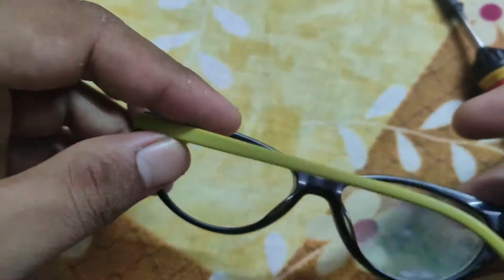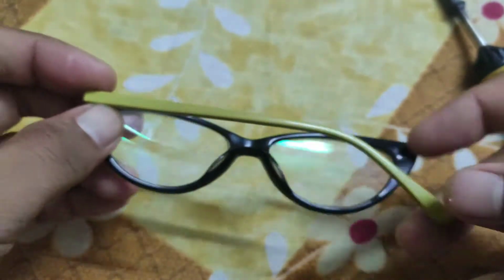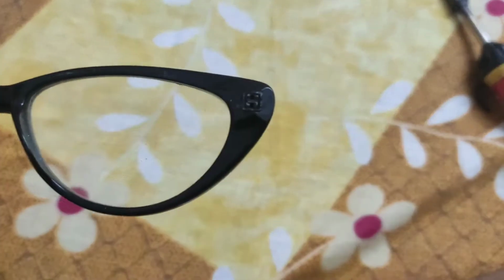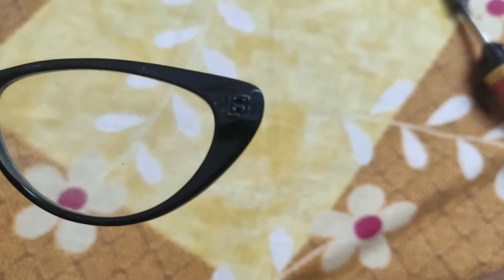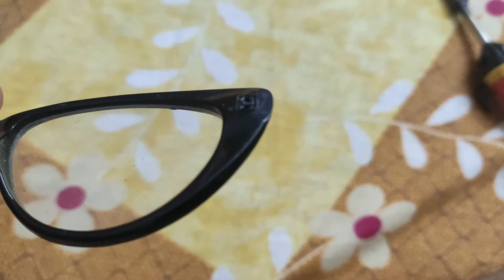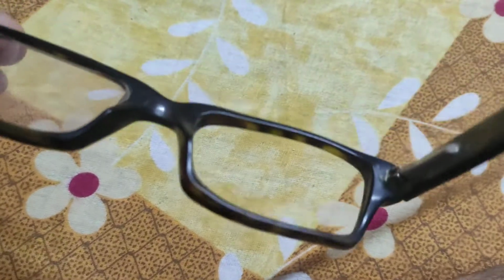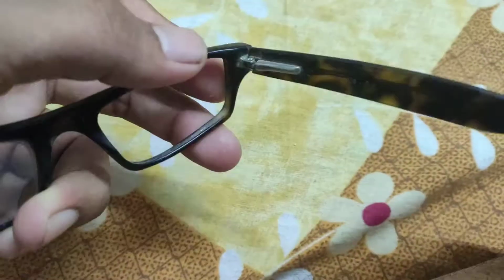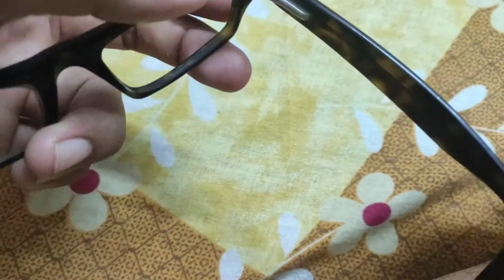You can see here the hinge is broken, and I took it out from the glasses. So I will show you how to take it out. I didn't mention here, I took this hinge from an old glasses, and I will fix this hinge to that one.